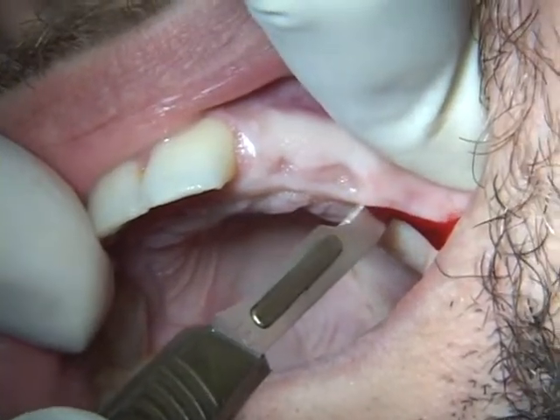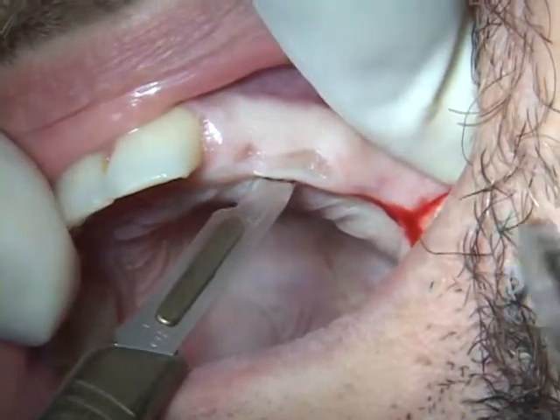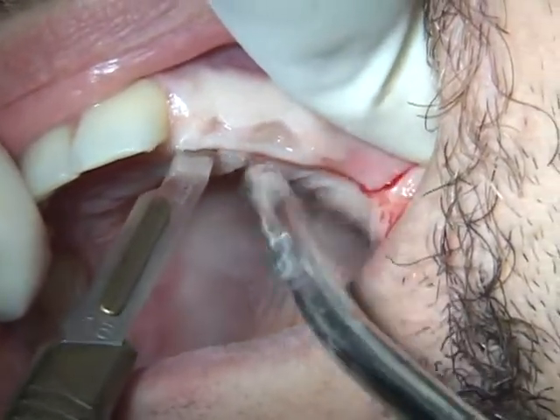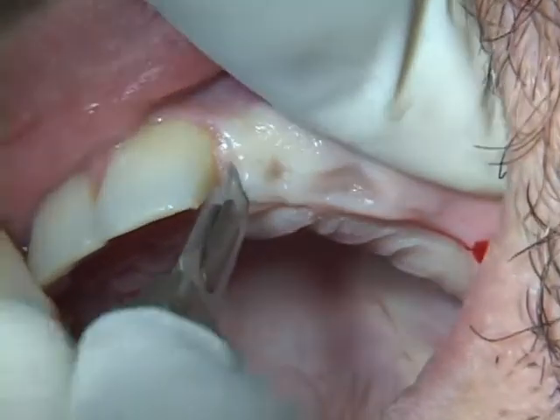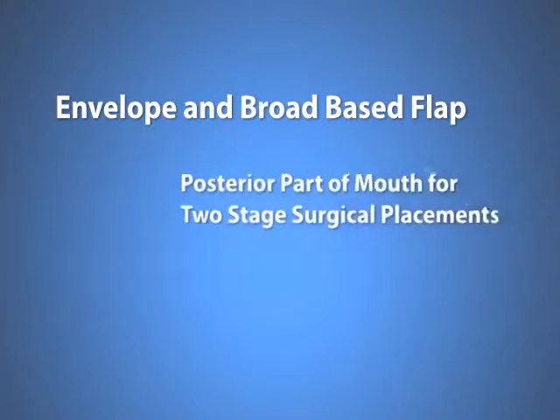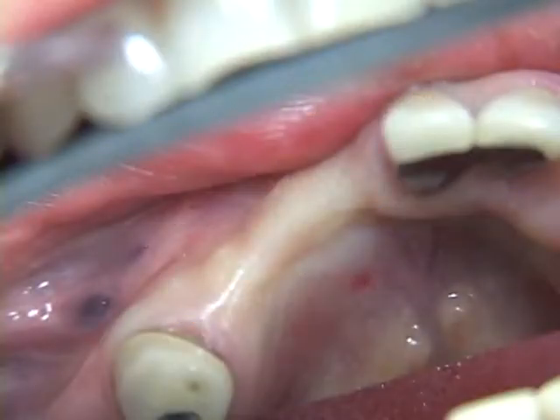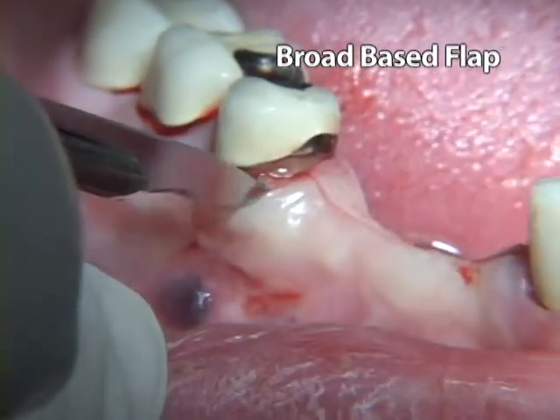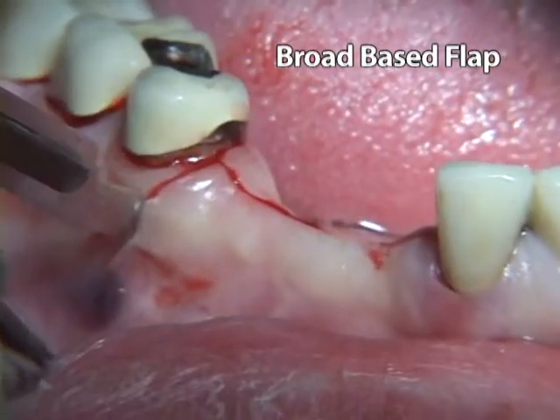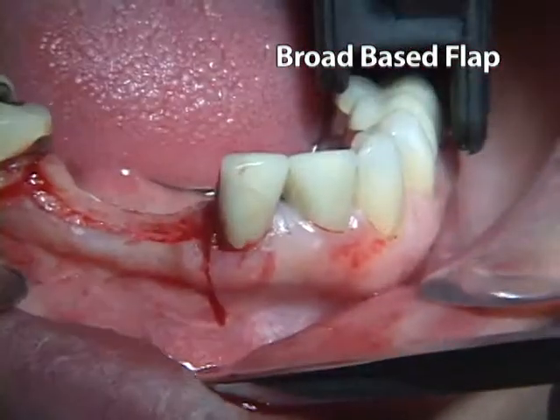After the appropriate local anesthesia, initiate a broad-based pedicle flap with the crestal incision slightly palatal or lingual to the actual crest. The envelope flap is recommended for use in the posterior part of the mouth for two-stage surgical placements and in areas with a narrow alveolar ridge. The flap consists of two parallel incisions next to the papillae, joined by one transverse incision, which is made palatal or lingual to the crest of the ridge.